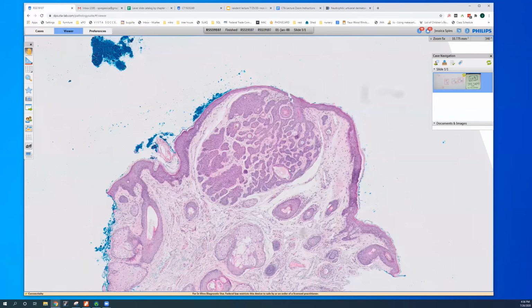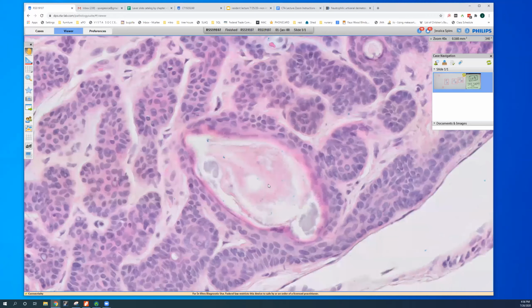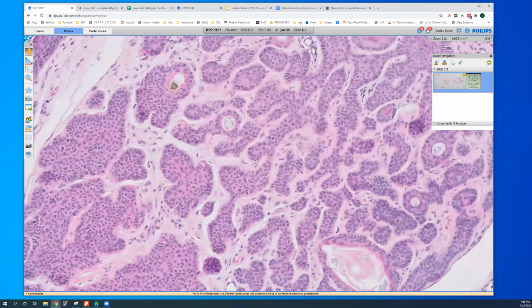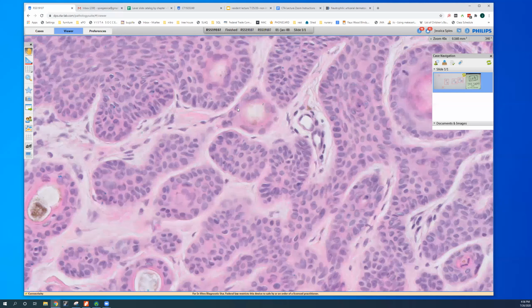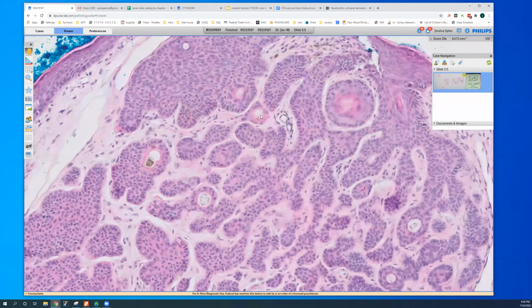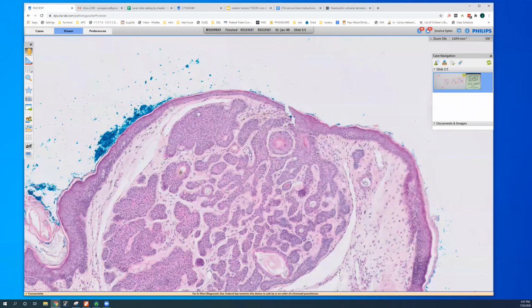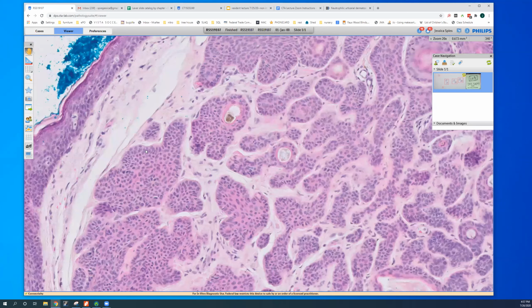So we've got what looks like a tumor at low power. It's very circumscribed. It almost looks like a keratinous cyst here. The more duct-like structures or little cysts. Maybe they're ducts. Actually, see here, they have this pink cuticle. I think this is a duct for sure. And over here, a duct. And you can see there's some clefting around the tumor, but it's not really around the nest so much.